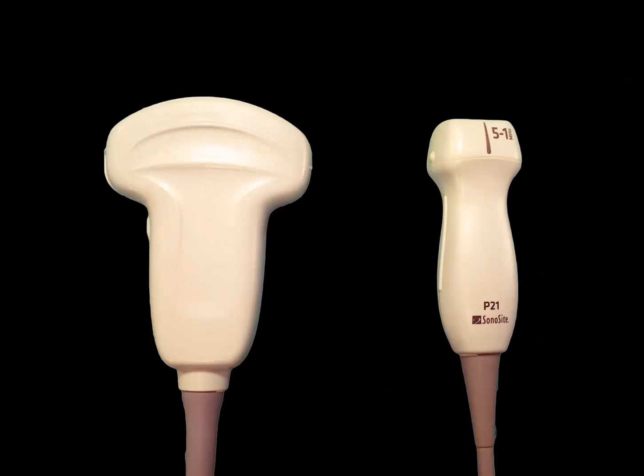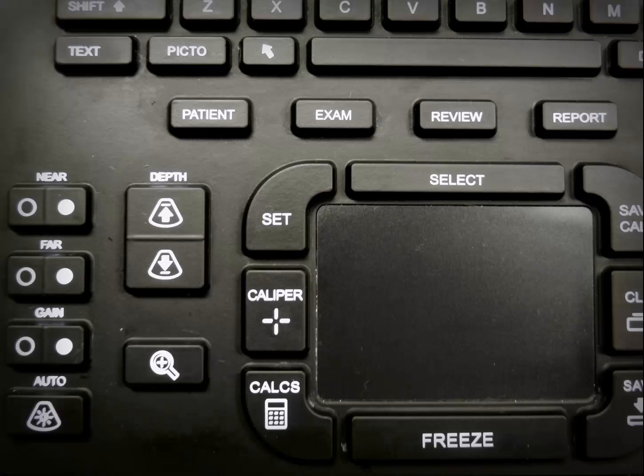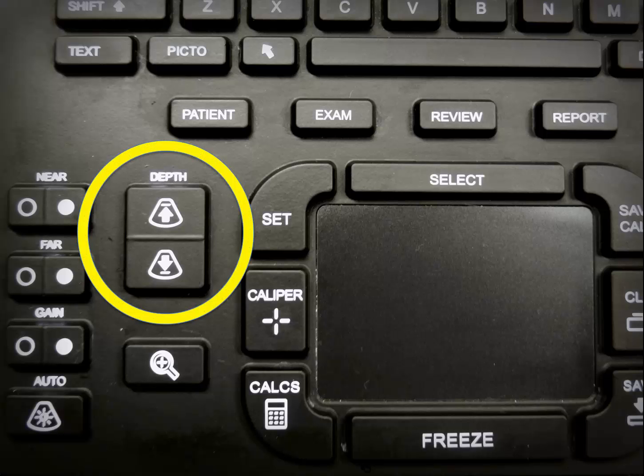On the right is a picture of the cardiac probe. Notice its smaller footprint in relation to the Curvilinear probe. For the present time, we suggest you start with a Curvilinear probe, as it may be easier for you to handle initially. Once the Curvilinear probe is selected, you want to increase the initial depth to maximum, about 20 centimeters.